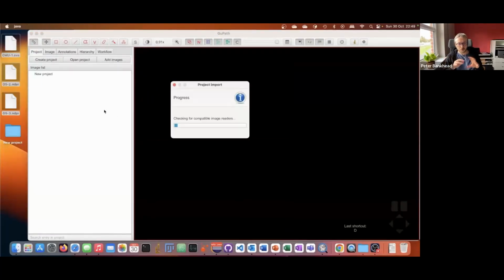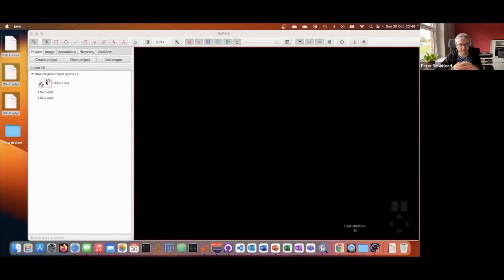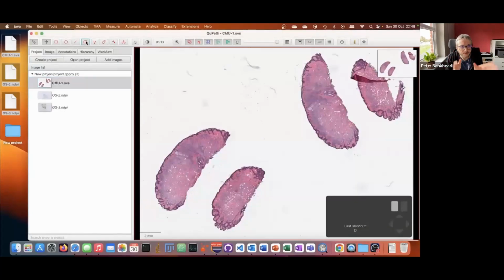So this is going very quickly, so don't worry about taking in everything here. What I've done is QuPath will manage your images in a project. So I dragged an empty folder on top because I really like ImageJ's drag and drop. That created a project. Then I dragged 3 images on, that imported them in my project, and you can see them on the left. Currently, what I want to do is to measure the size of the 4 different bits of tissue within this image.